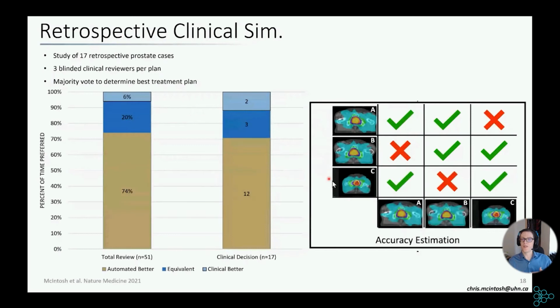So imagine that patient C was not well planned. The clinical team was very stressed that day, didn't have much time, et cetera, and so it just didn't end up with the best quality of care. That patient will be a poor atlas for all of the other patients, and therefore will have a low score. And for a novel patient, we always try to use the atlases that are predicted to have the highest scores. So there's a kind of bias towards the best treatment plans within the system, which ends up being a good thing.